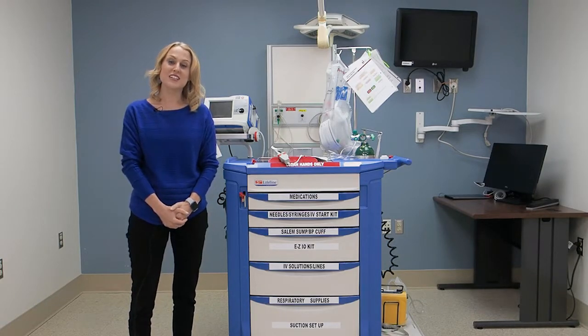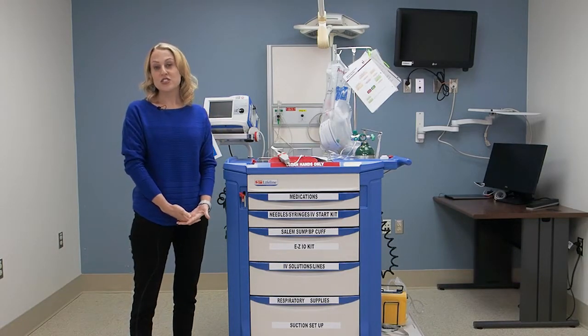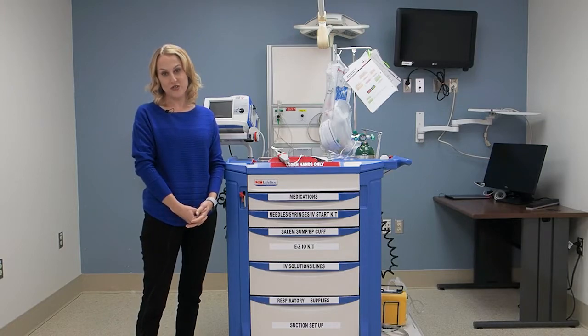First thing I want to discuss is the importance of knowing the location of the crash cart on your unit. It's so vital. And should you get pulled to another unit, make sure that one of the first things you do is determine the location of the crash cart on that unit.